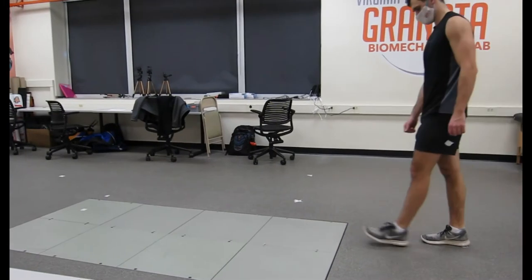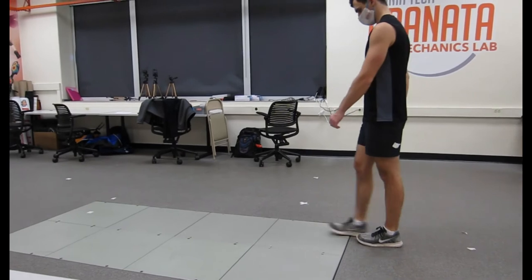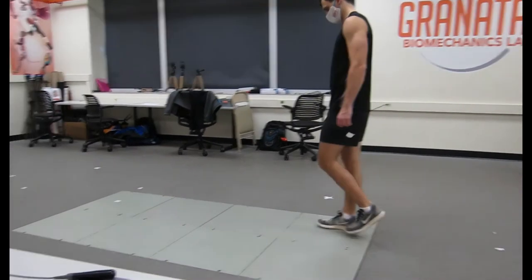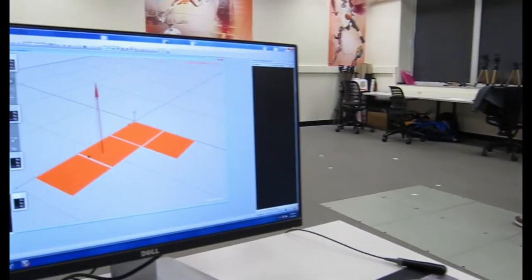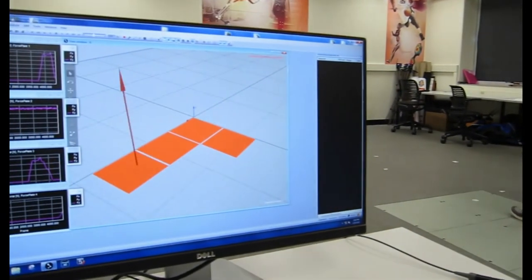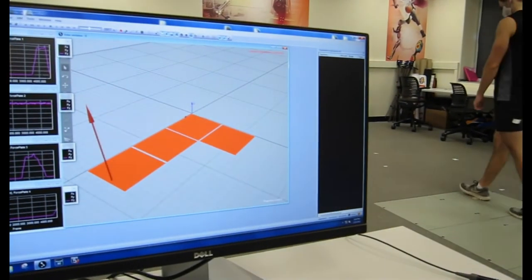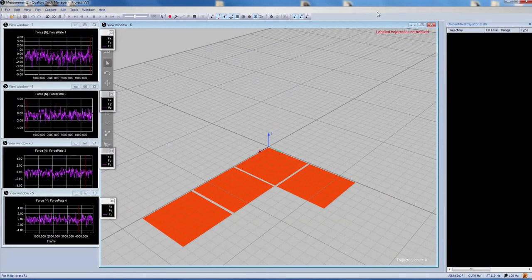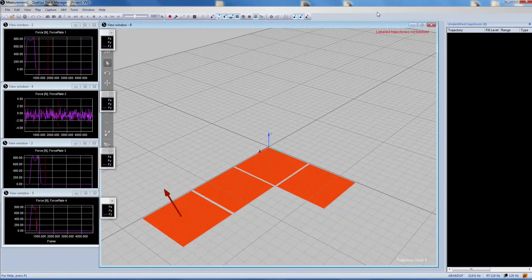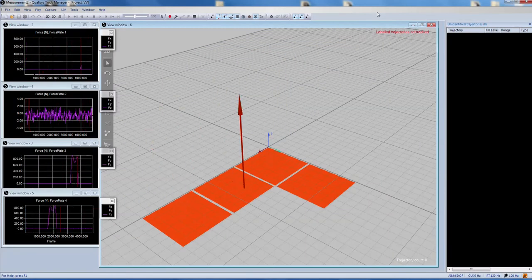When a person applies force to the force plate it sends a signal to the system and the ground reaction force is displayed on the computer screen for the researchers to use. It shows the magnitude and the direction of the force.